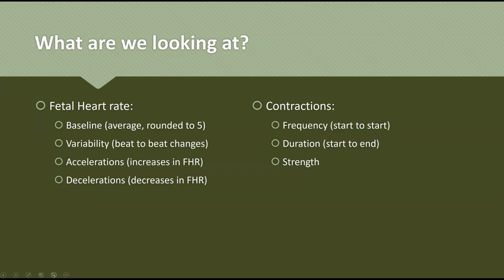So it's usually a range in seconds. And then the strength of contractions corresponds to being mild contractions, moderate contractions, or strong contractions. We can only tell realistically the strength of contraction by using an internal contraction monitor, an IUPC, that stands for intrauterine pressure catheter, or palpation, using our hands on the woman's abdomen to palpate the strength.